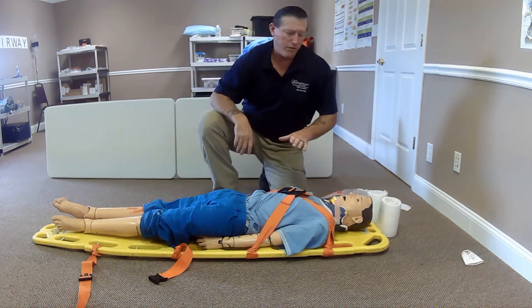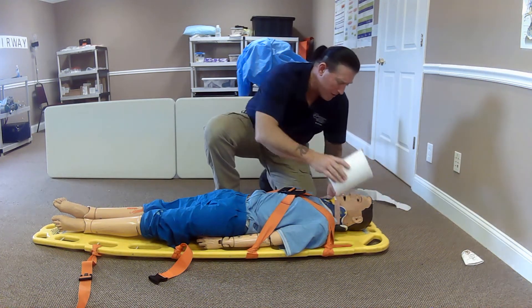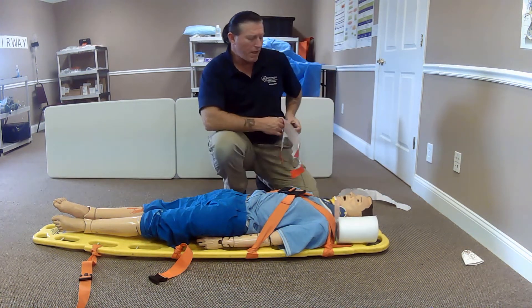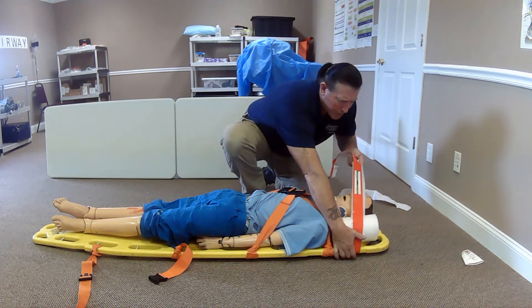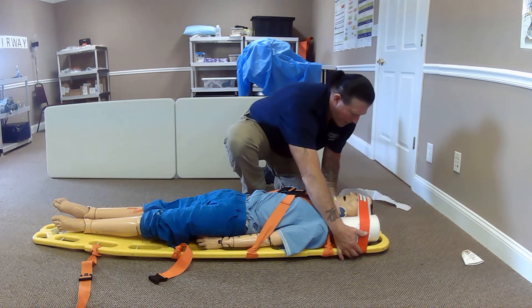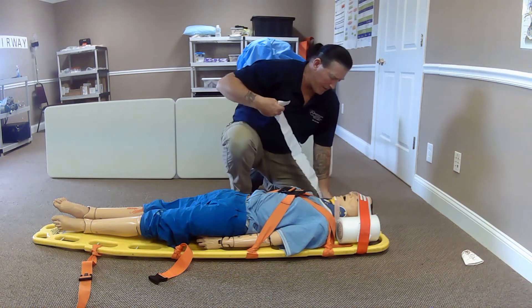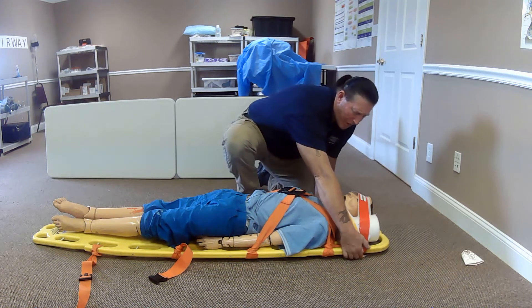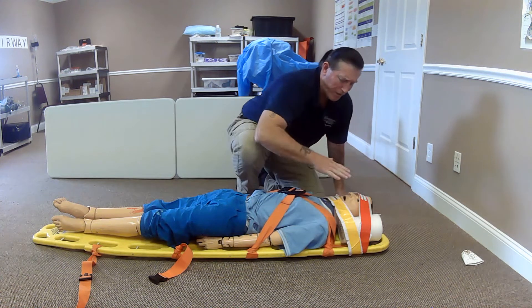I will now secure the head to the device. I'm going to do this by using first my head blocks on either side of the head. I will take one piece of tape, come across, apply it to the bottom of the board, across the forehead, and then tape to the opposite side of the board. I will now apply tape to my chin — the same style, from one side of the board to the other.